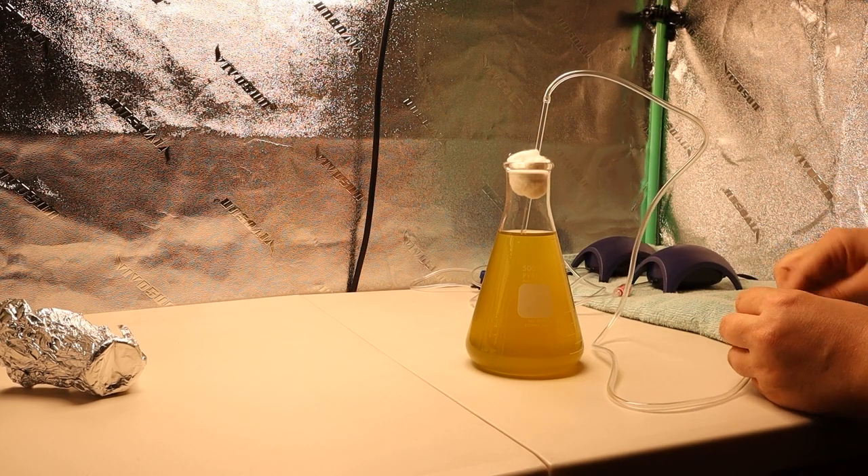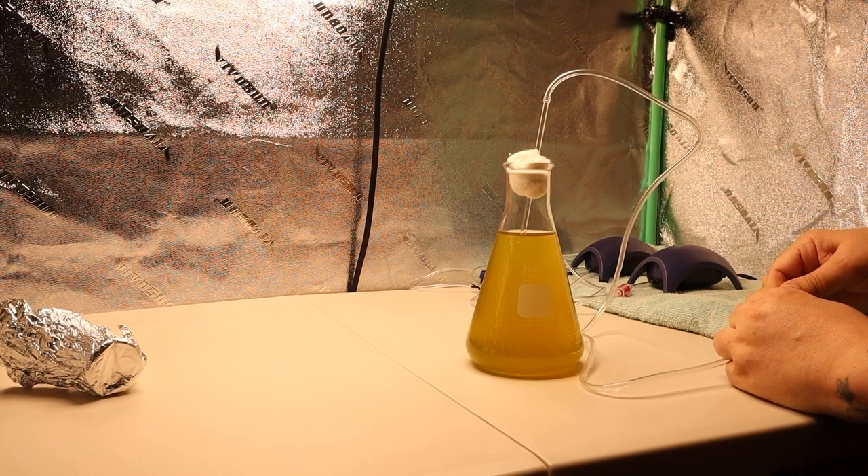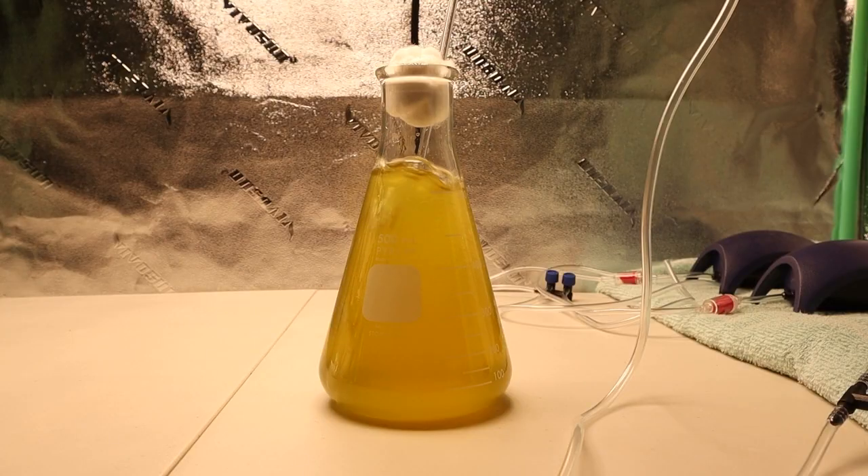Hook it up to the air pump and plug it in. I'll let this run for seven days and I take a picture every day to see how dark it's getting, and once I see it's no longer getting darker I'll go ahead and harvest the phytoplankton. I'm going to cut to an update on day seven and then I'll show you how I harvest.